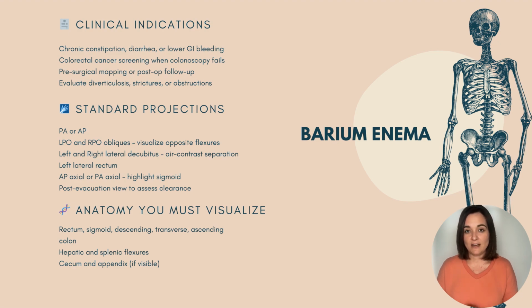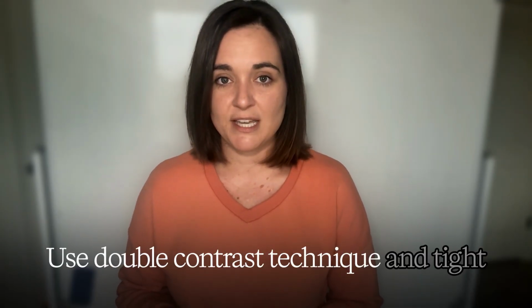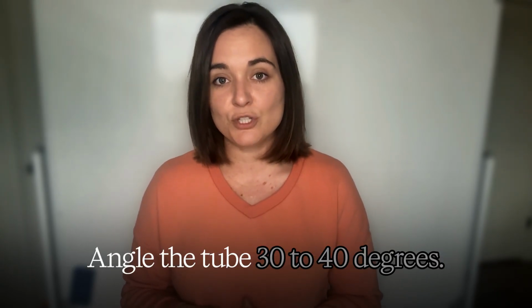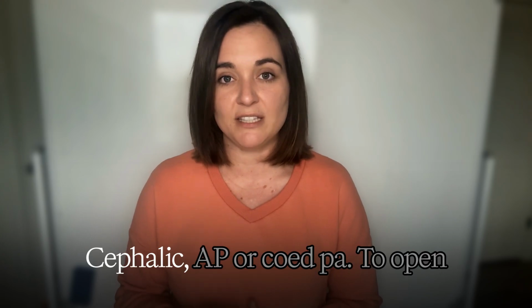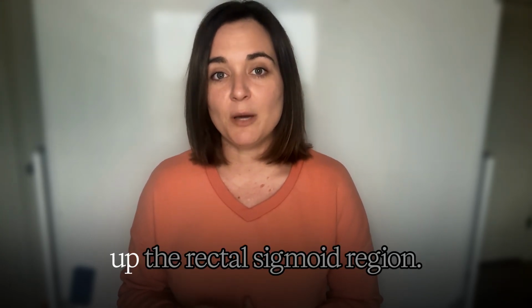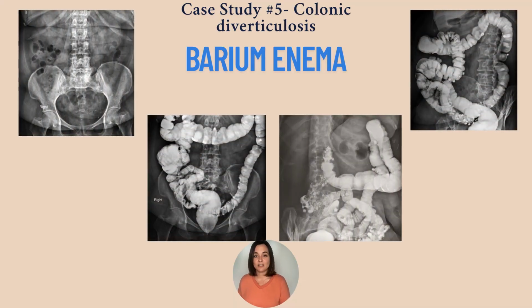Your left lateral demonstrates the rectum. Your AP axial or PA axial highlights the sigmoid. The post-evacuation view assesses clearance. Positioning tip: for decubes, use double contrast technique and tight collimation. For the axial sigmoid views, angle the tube 30 to 40 degrees cephalad for AP, or caudad for PA, to open up the rectosigmoid region. Next up, colonic diverticulosis.